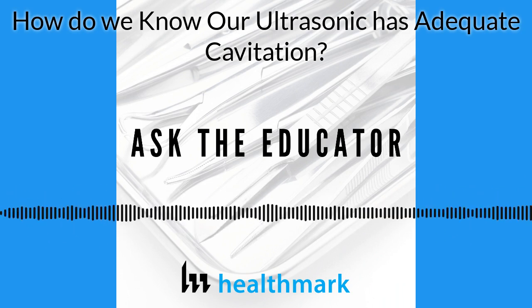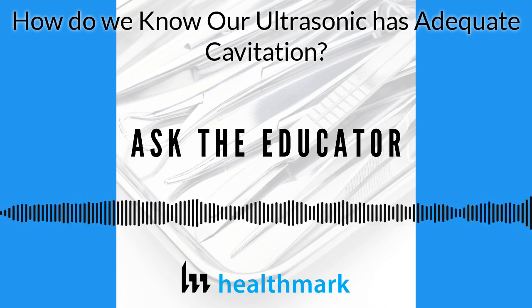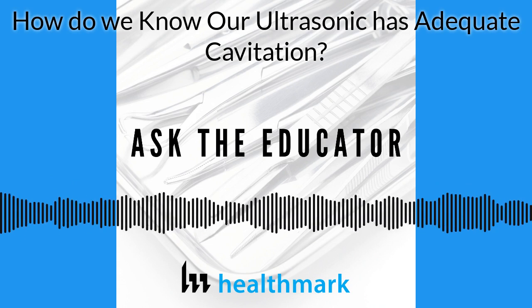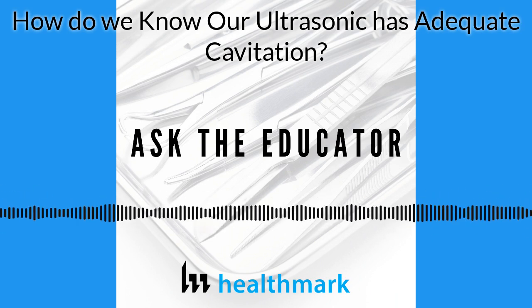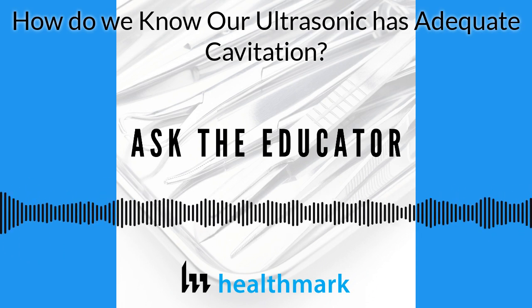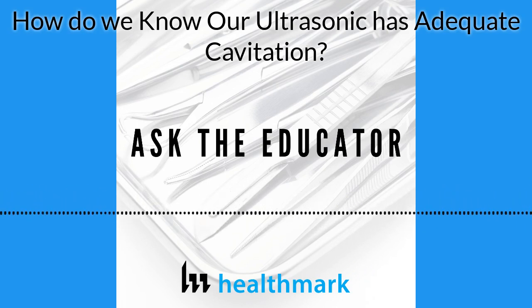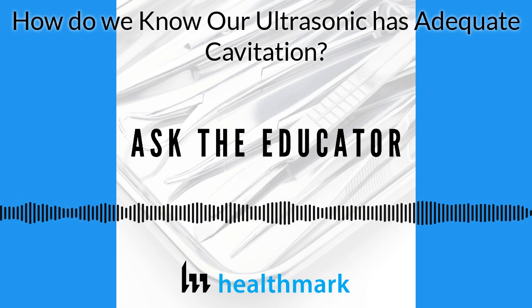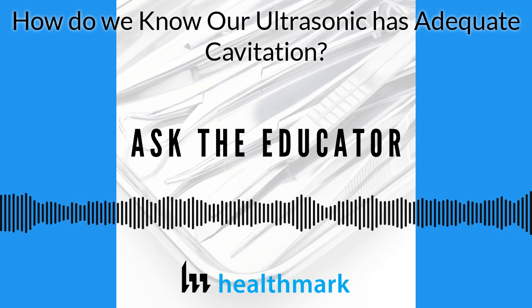That does make sense. I think of this as a big eye opener, at least it was for me, because I see these questions come in and people are investing many, many thousands of dollars. Even one multi-level chamber ultrasonic will oftentimes cost over $100,000. And then these managers are calling and asking why either the second or third tier up isn't passing the test. As a former manager, I would use that to say, well, those certain levels aren't getting cavitation energy. I shouldn't be using them.